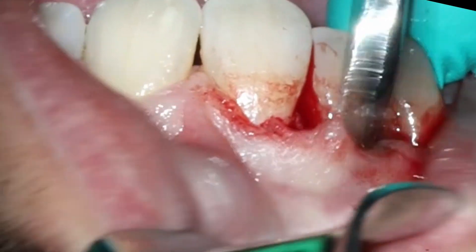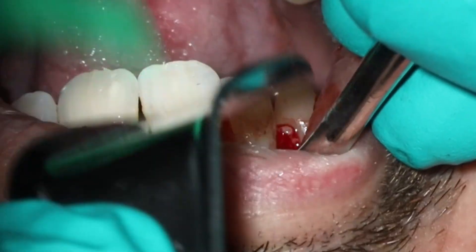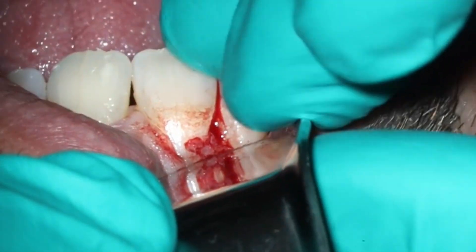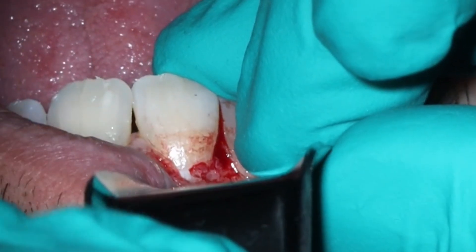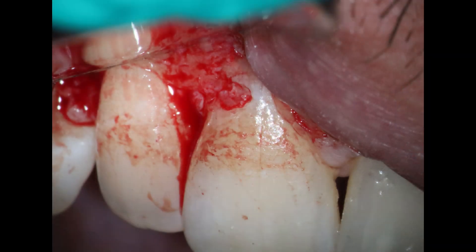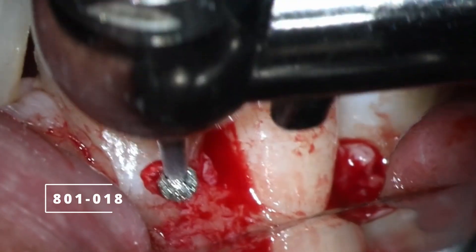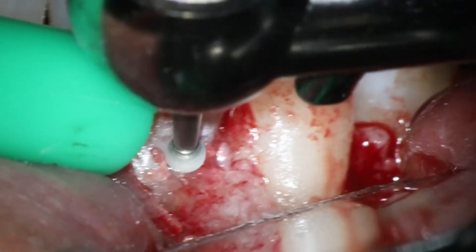What I'm trying to do is get this area completely exposed so I can get in there and clean it out. This is going to be a little bit tedious — I did cut out some of the extra parts because it takes some time to get all of the resorption out. What I'd like to do in these cases is start the case and then use calcium hydroxide as a way to help kill any remaining parts inside. You can see that's where the resorptive defect looks like. I'd like to use that calcium hydroxide to remove anything on the internal aspect, and then we're going to go and do the external repair.